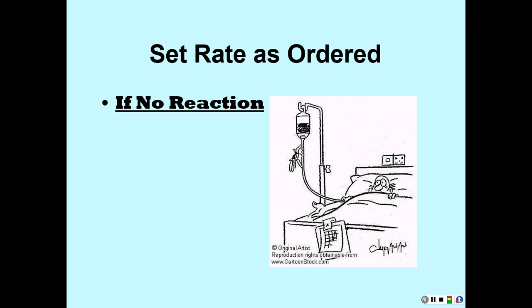Some places, I know that we've done this, if somebody's getting a lot of blood and they're still getting IV medications, and we've got to give them Lasix and do all that, we'll just start a saline lock for all that extra business while their blood's going. So use your judgment. Is there a hard and fast rule? No, because your patient may not have another vein, so you may have to disconnect. The more you can keep from disconnecting, the better it is, but it ain't always that you don't have to do that.